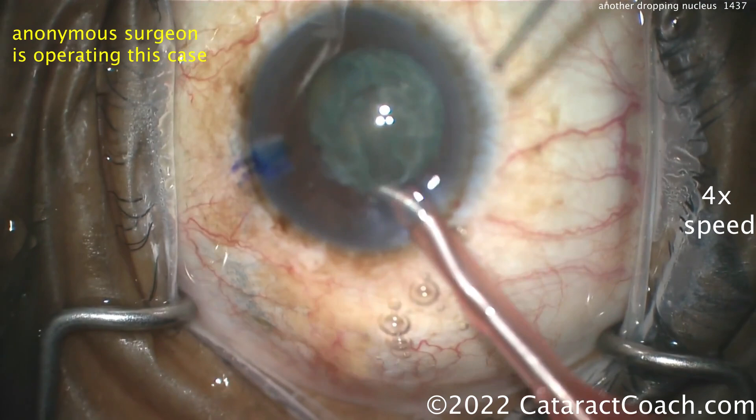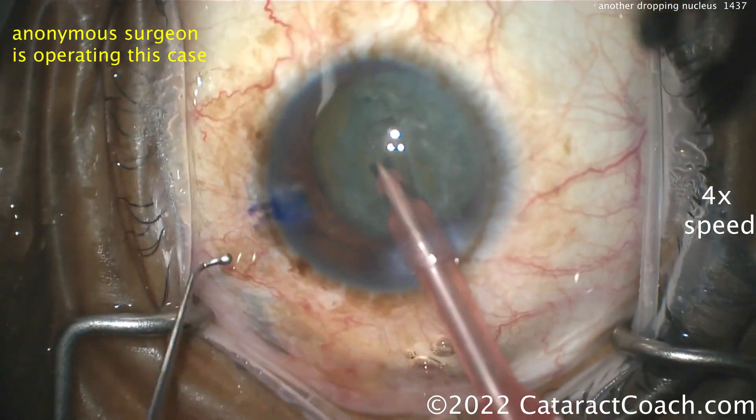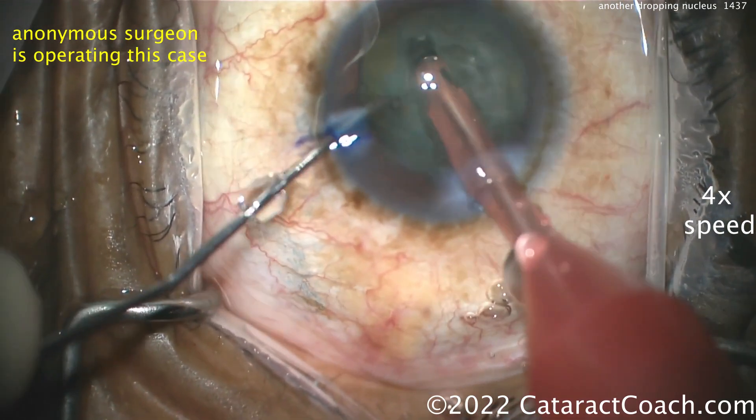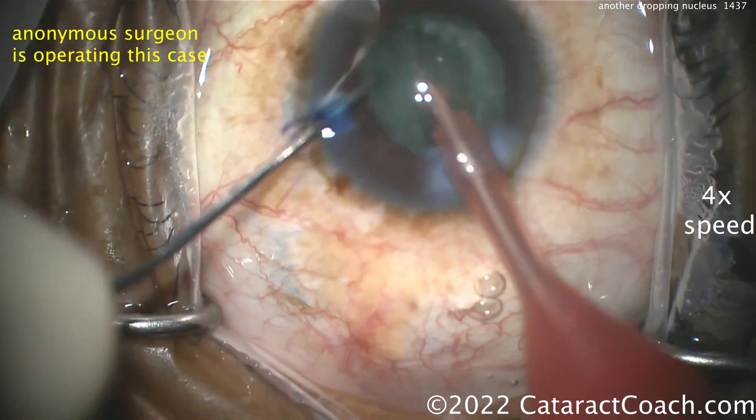More viscoelastic, faco probe back in the eye, chopper going in as well. And look — that's a deep spot I don't like. That one spot there nasally is concerning.